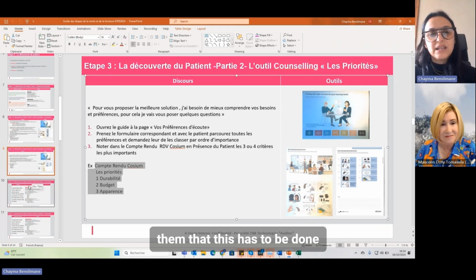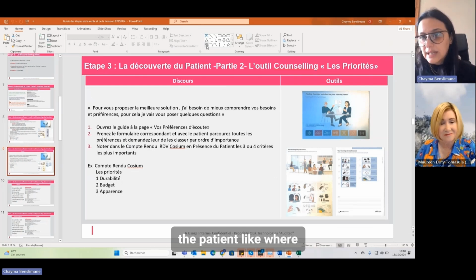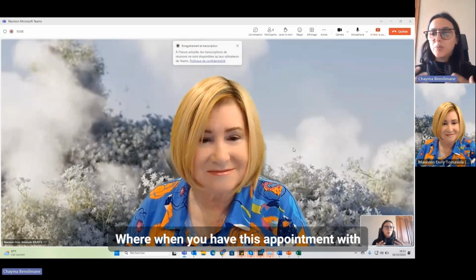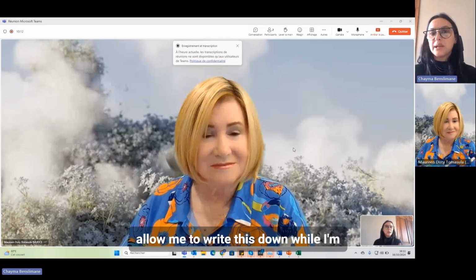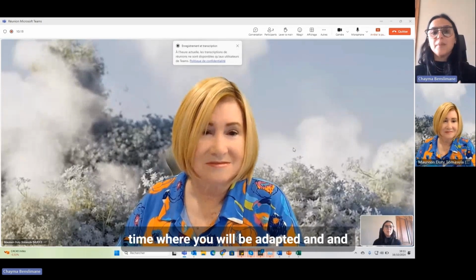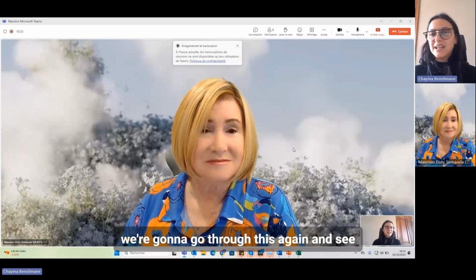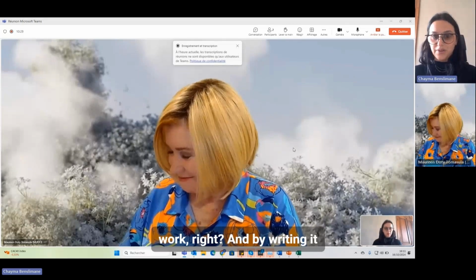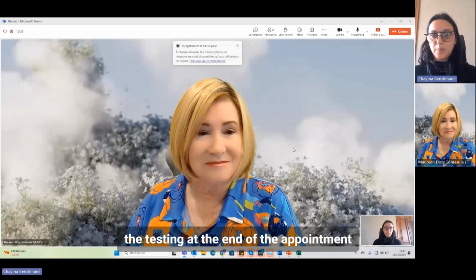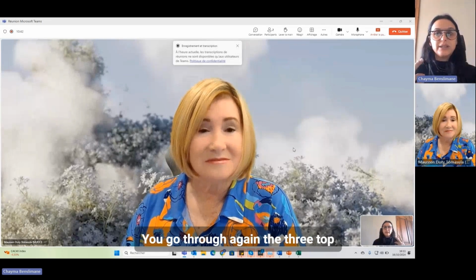And then I explain to them that this has to be done with the patient. Just to give you an idea, when you have this appointment with the patient, you tell him, allow me to write this down while I'm talking to you, because this will give us a starting point. On the next visit, when you finish the adaptation period, we're going to go through this again and see, is it still hard for you or does it work? And by writing it down, at the end of the appointment, once you have tested the product you've proposed to him, you go through the three top preferences again.